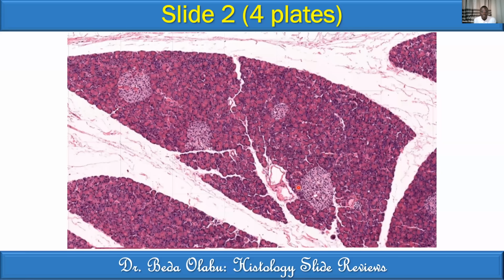Then going to second level of magnification, we'll just put additions. We see blood vessels like those ones. Those are blood vessels. They're not ducts because they're not lined by simple columnar or simple cuboidal epithelium. So they're not ducts, they're blood vessels. And essentially, when you see them running in pairs like that, most likely one is an artery and another one a vein, if it's not a point of bifurcation. We confirm that the lobulations are there. And so we're looking at just one big lobule or maybe two small ones.